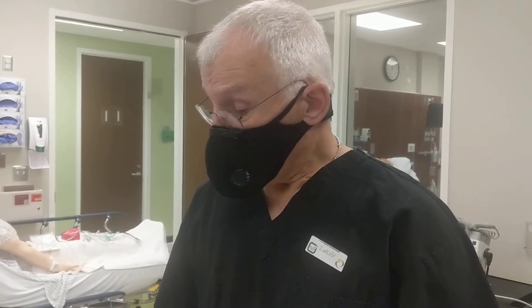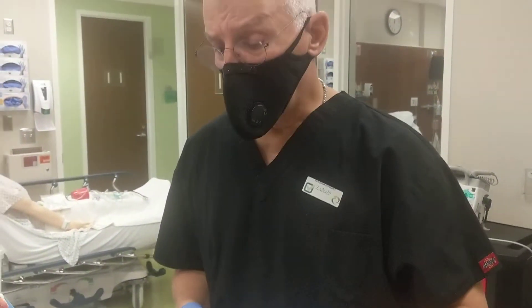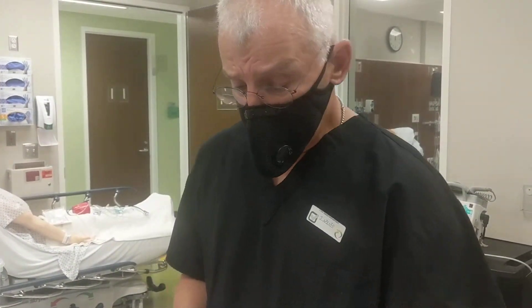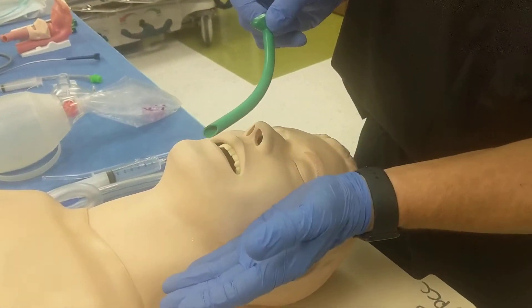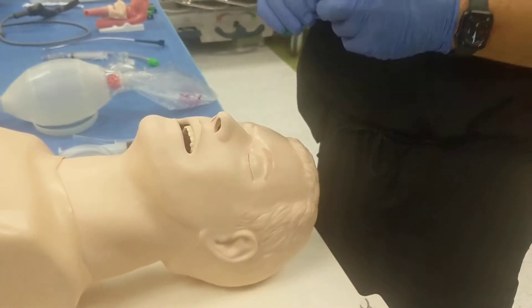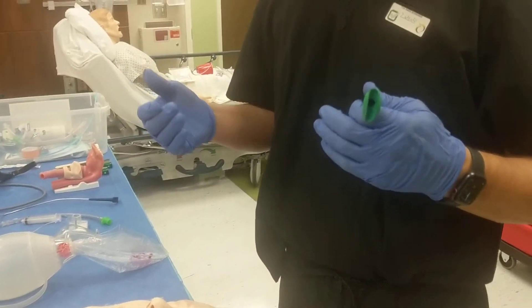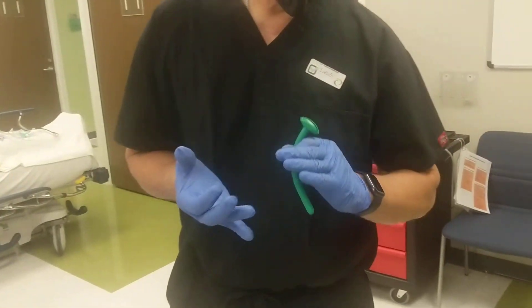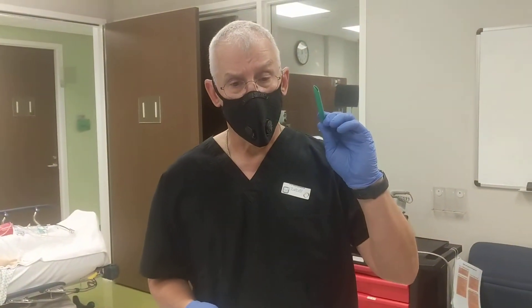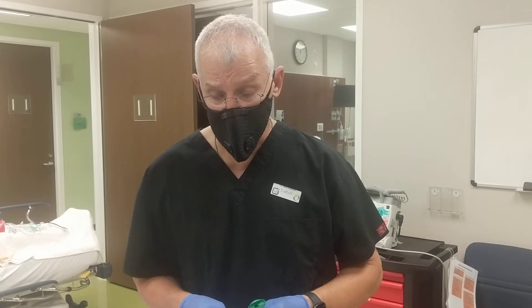This is usually characterized by sonorous breathing either spontaneously or if we're using an ambu bag, suggesting the tongue is partially obstructing the airway. This device is designed to go into the nose and all the way around posterior to the tongue, getting beyond the point at which the tongue is falling against the oral pharynx, allowing the patient to be ventilated. The patient can be either awake, semi-conscious, or unconscious. Most patients tolerate having a tube in their nose fairly well even in the conscious state.